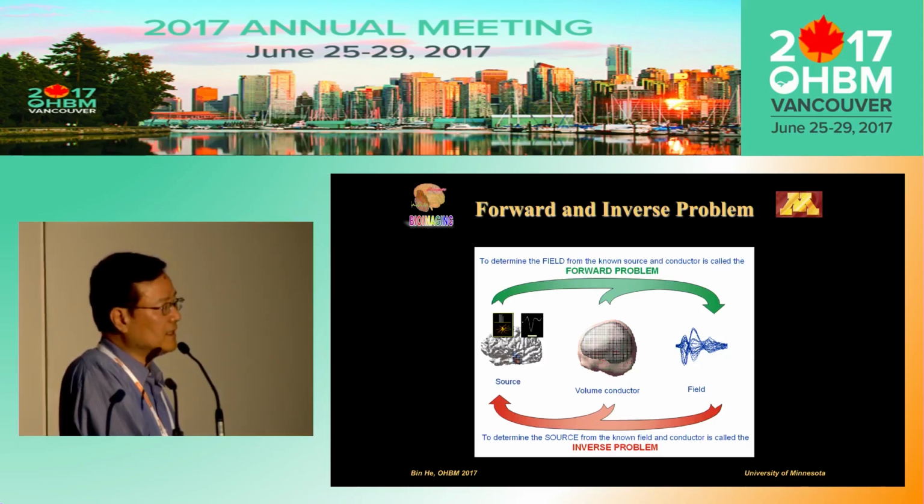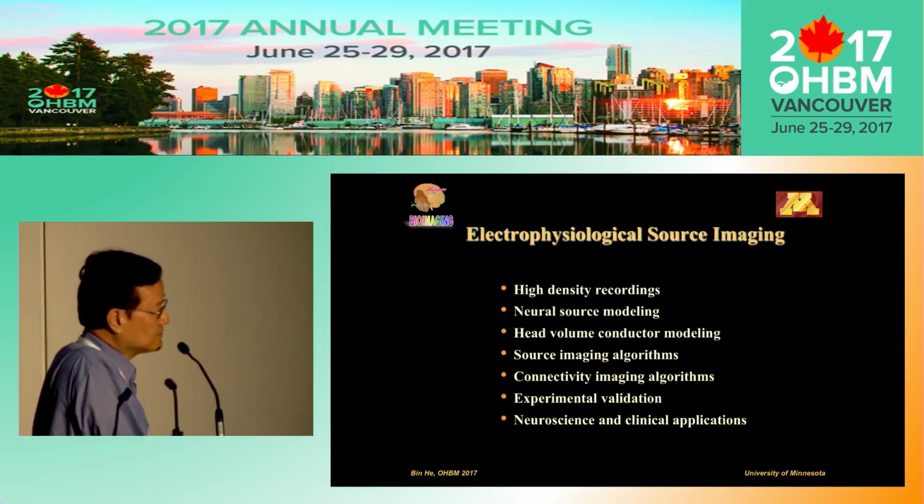But if you get an experimental or clinical recording of EEG or MEG, you solve the inverse problem with the knowledge about the volume conductor model. That is the so-called inverse problem. This inverse problem is going to give you the source distribution inside the brain. From there, you could obtain the functional connectivity further. So that is mainly the topic of this workshop, and that will be my presentation as well.